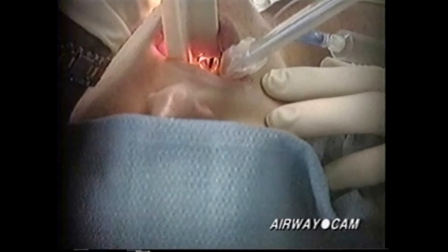Although the laryngeal view on this patient is excellent, the white of the true vocal cords is barely seen. Anterior to the glottic opening is the epiglottis. Laterally are the aryepiglottic folds, and posteriorly are the posterior cartilages and the interarytenoid notch.